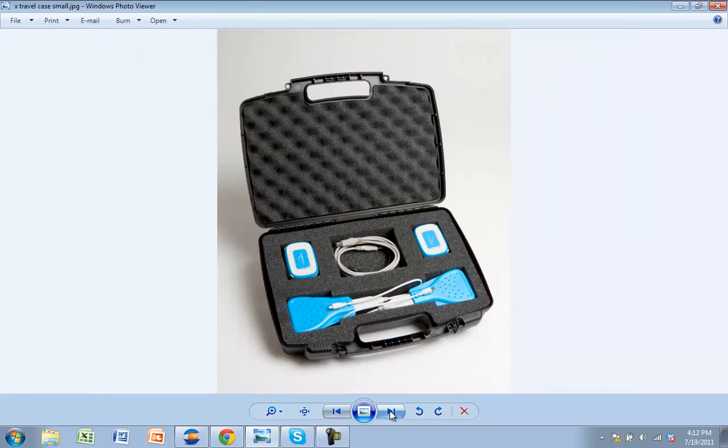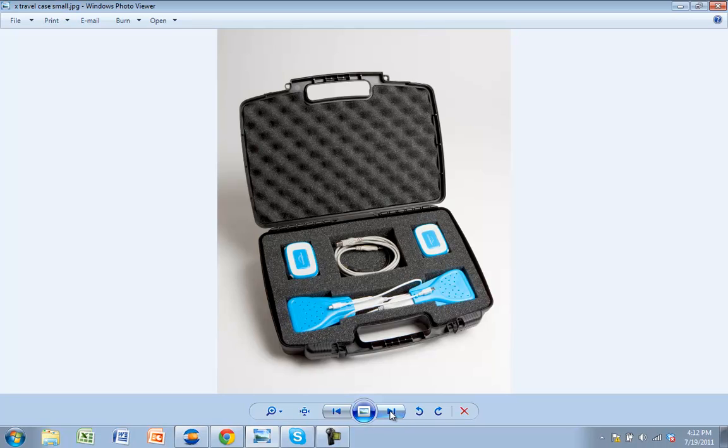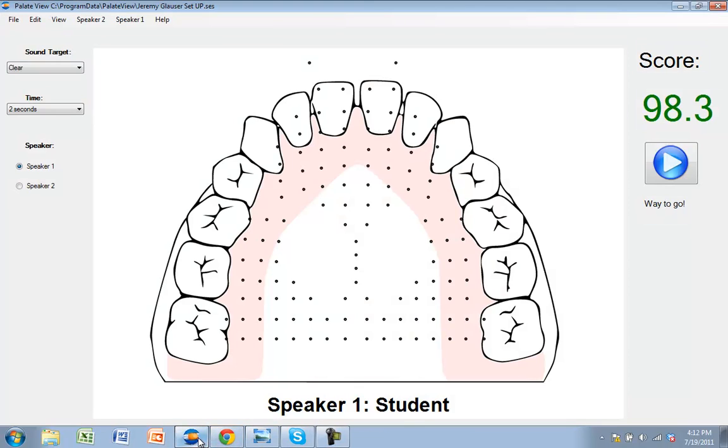Your two-user Palatometer system comes in a case like you see on your screen so that you can transport and protect your equipment. Let's go ahead and jump into the software and show how it works. I'm going to launch the software and pop in my Smart Palette.